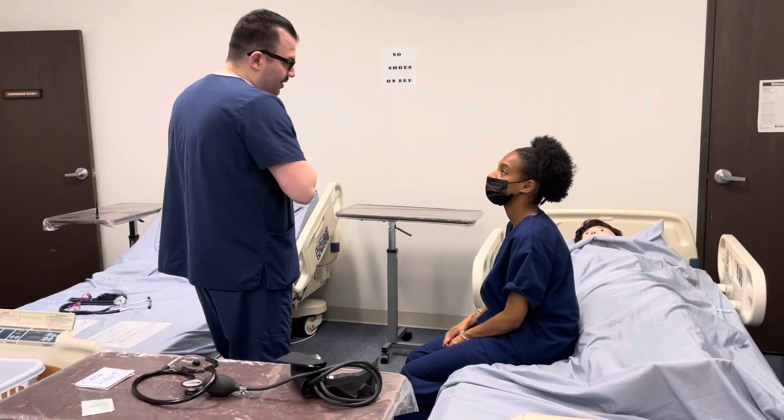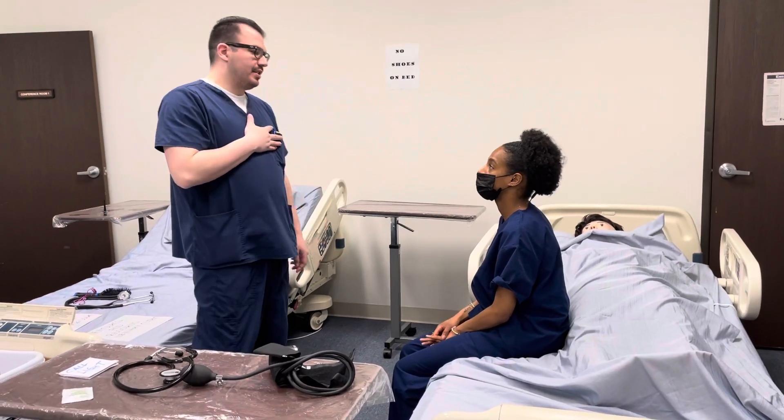Good morning, Mrs. Smith. My name is Chris. I'm going to be your CNA today, and I'm here to take your blood pressure. Is now a good time? Yes.